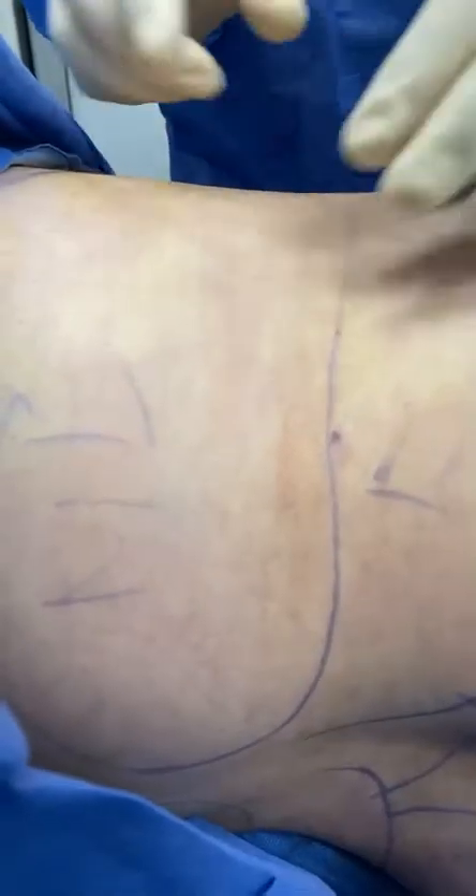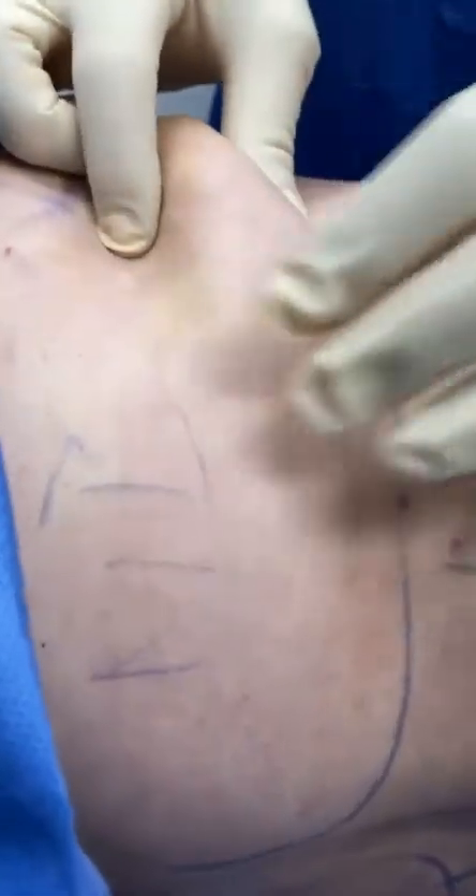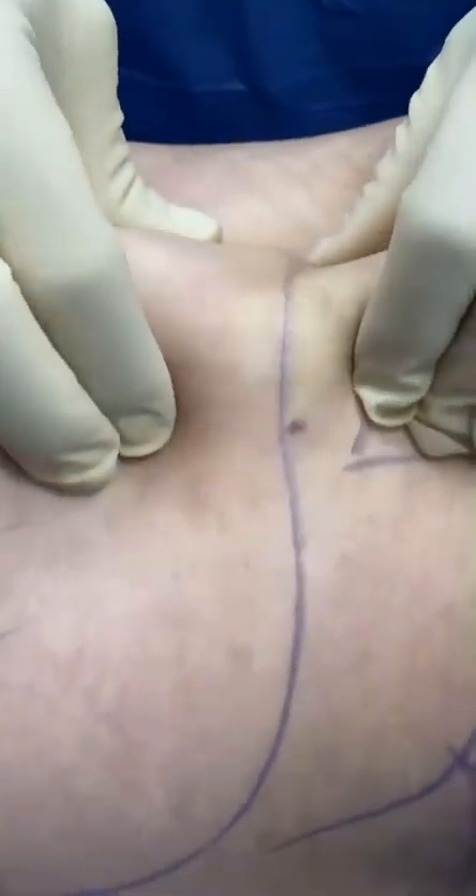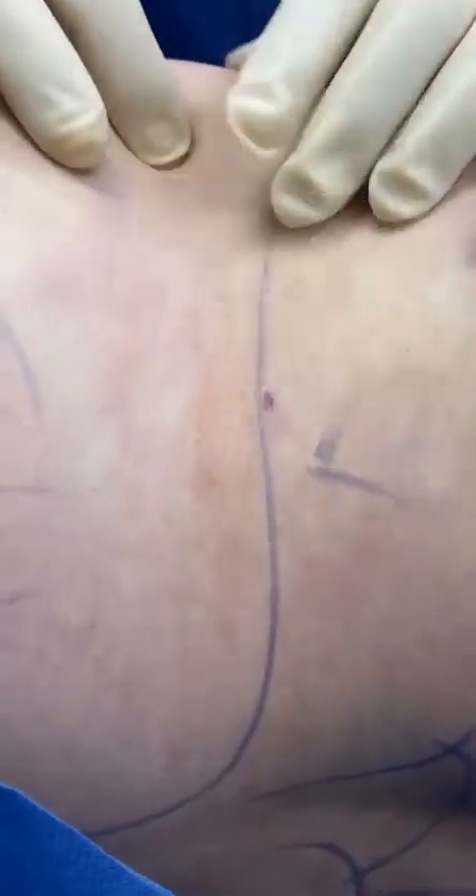We already started on this side, but I just want to show you the difference. See the pinch? Look at all this fat — you saw on the other side how there was none. Even if I were to pinch small, I cannot — there is a lot of fat here.